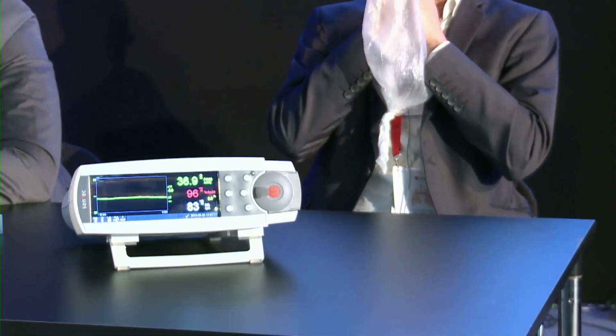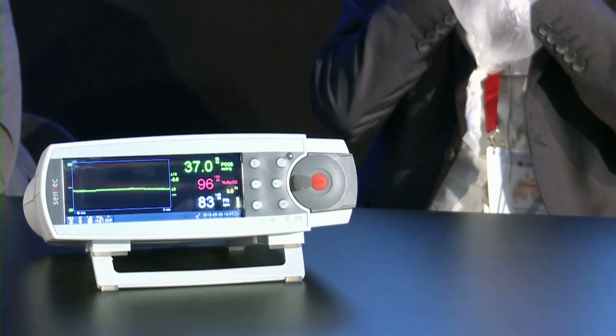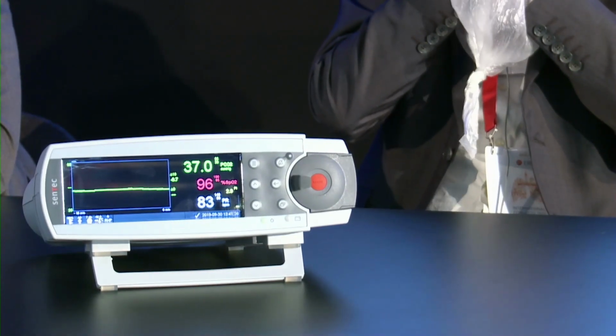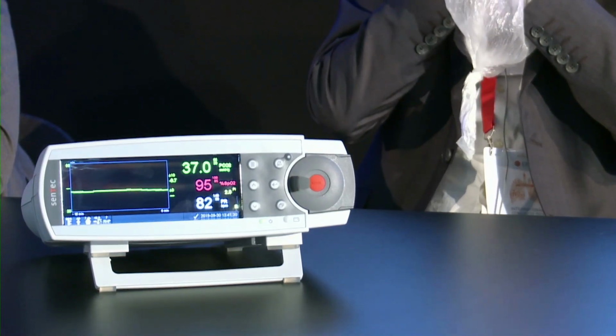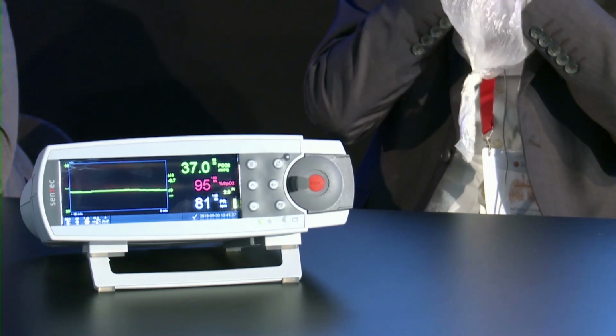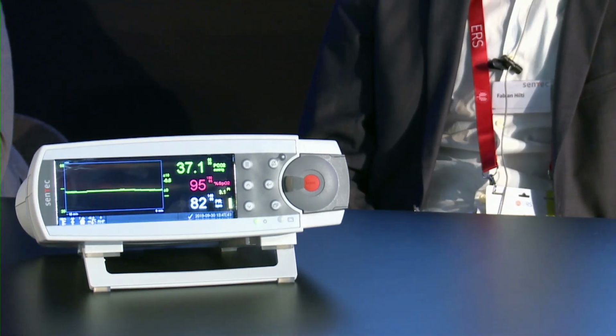So we started with 36.9. So now CO2 increases, and we will see over the next seconds and minutes that CO2 will further increase. It took us 34 seconds. I think that's pretty fast, isn't it? Okay. So Fabian, I think you can stop rebreathing because we do not want to ventilate you later.